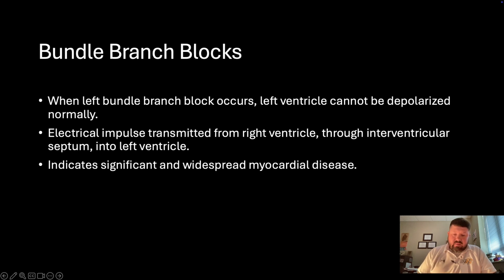So one thing that Dr. Sen, our current medical director for Southern Union, has told me in the past is if we see left bundle branch block associated with chest pain, we're going to treat it as an MI. So we'll treat it just like we would a STEMI, because this is very well showing us that you've got myocardial disease going on.